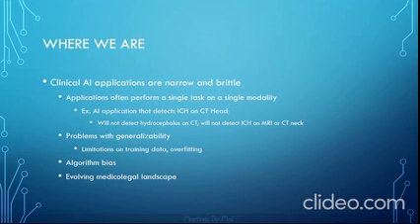What we have found is that more often than not, an algorithm can be trained to do very advanced tasks with a high level of accuracy on its own limited training data, but when it is challenged with images from other institutions or images from other machines or of a different patient population, performance can be significantly degraded.